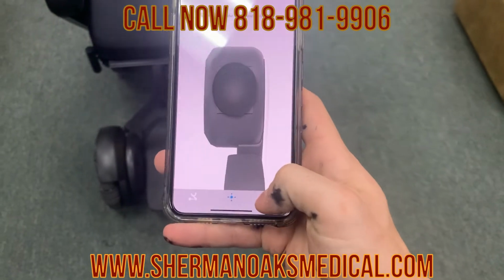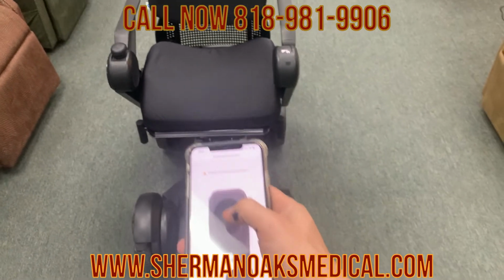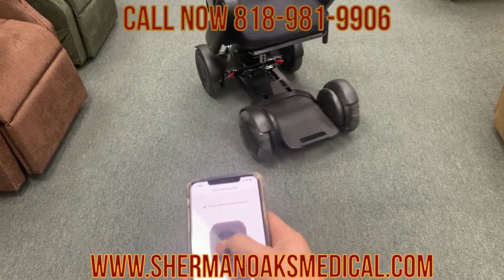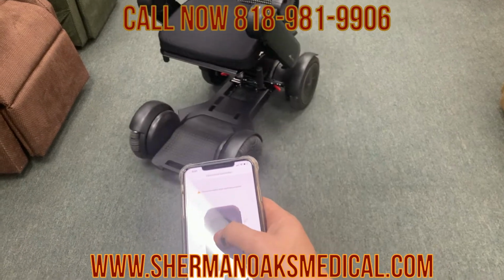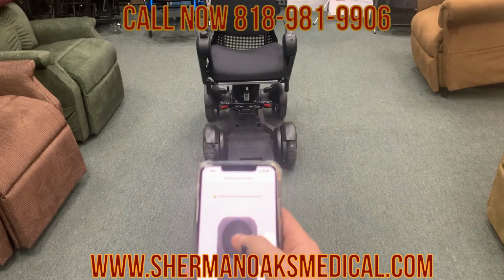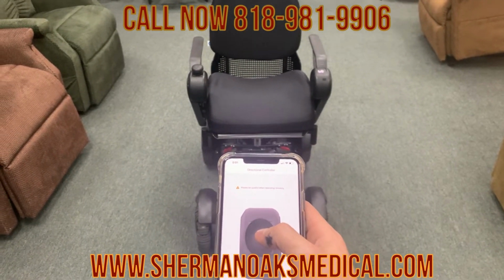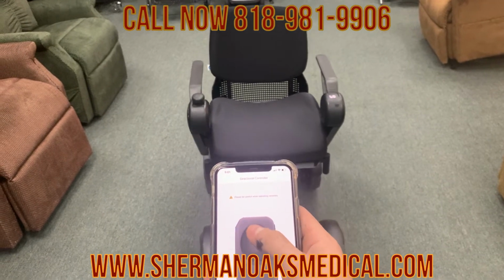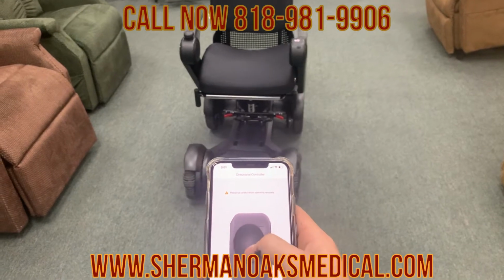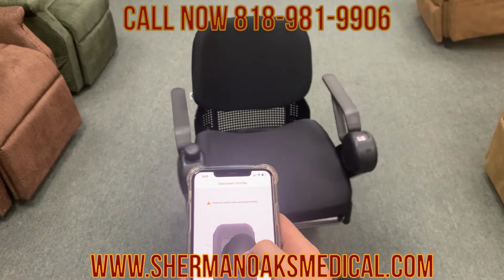The other screen we have here is our drive function. This is actually really cool. One of the coolest things about the Whill Model Ci is that we're actually able to drive it with our cellular device. This will only work on the iPhone. It's not available for Android, but it does allow you to do more and different features and functions with it. For example, going to the restroom, you can transfer off of it onto a toilet, get the device out of there, and bring it back in once you're a more advanced user. Or when you get into your bed, you can take it and just park it somewhere else. It just makes it a lot easier, and there are a lot of other things you can do with the device.